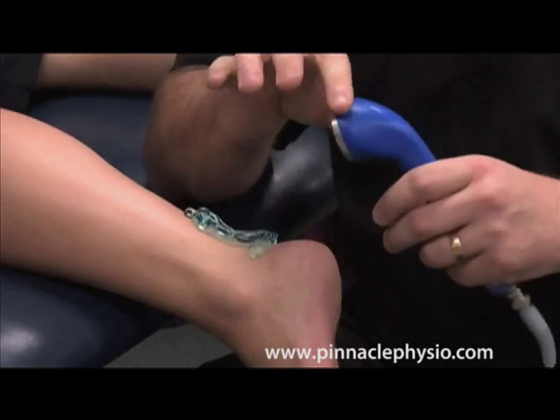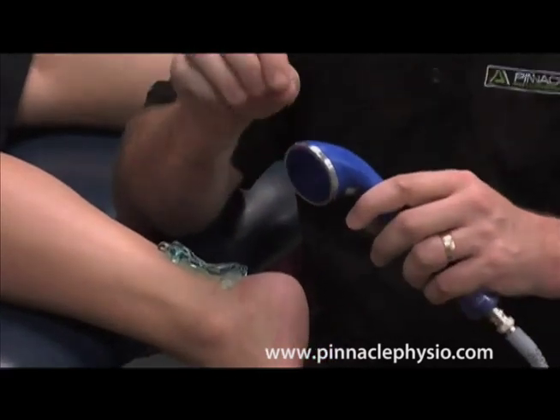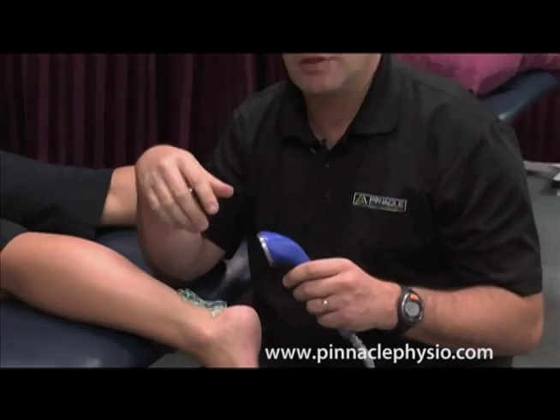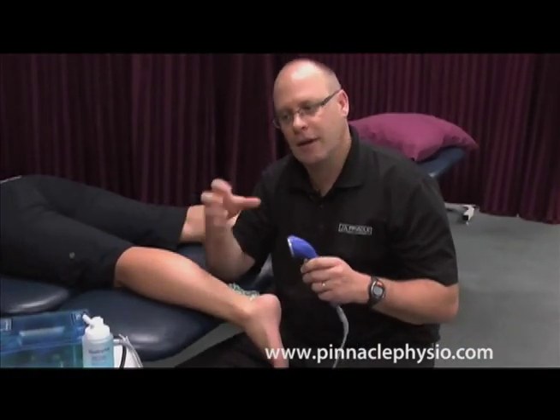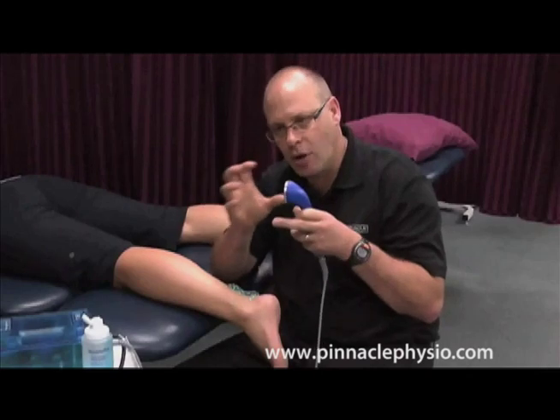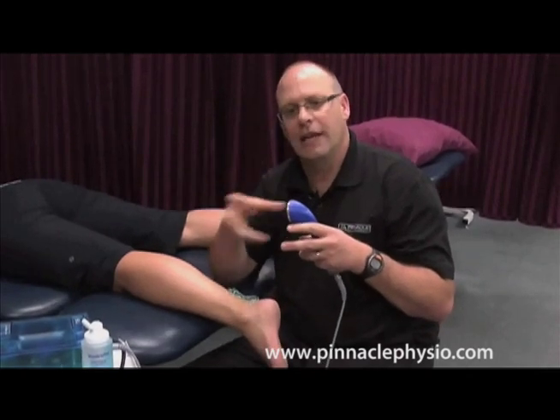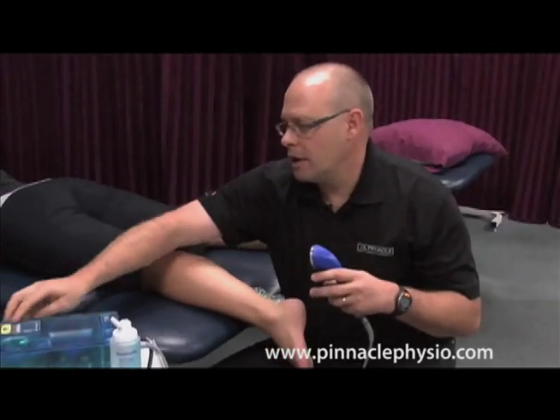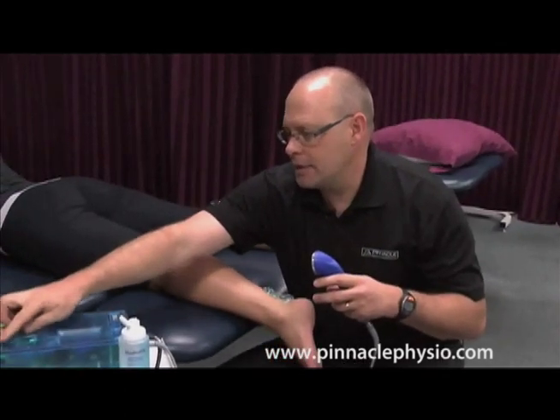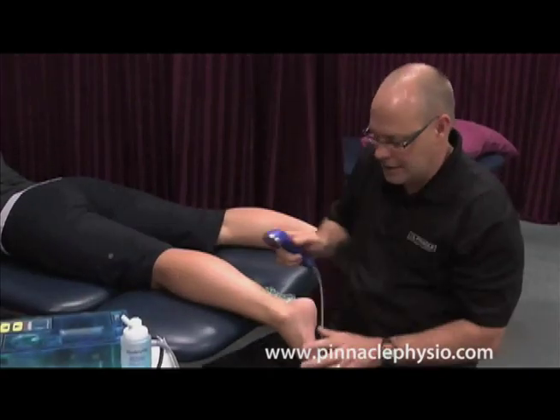By changing the frequency settings of the crystal, you can change the effects — you can get anti-inflammatory effects, or if you turn it up you can get friction heat inside, because the sound waves vibrate the molecules in the tendon to generate friction heat. It just depends on what intensity we have set up.